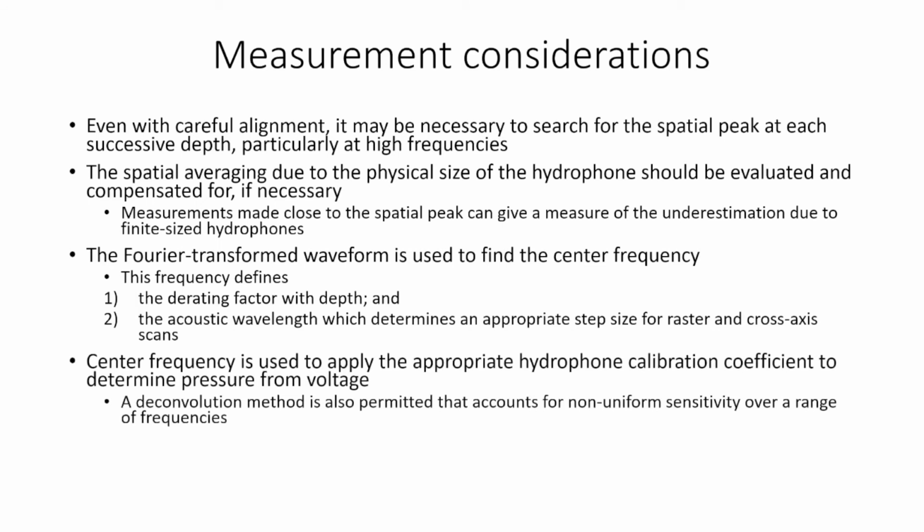The center frequency is also used to apply the appropriate hydrophone calibration coefficient. And you can do this in two ways. Both are permitted by the standards. One is to simply take the center frequency, use a lookup table to take your hydrophone calibration factor for that specific frequency, and multiply the voltages you receive by that factor.